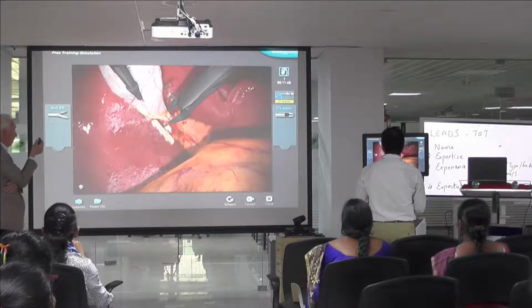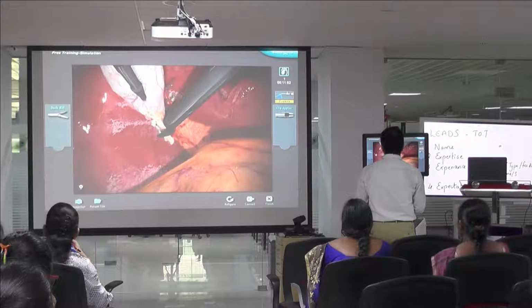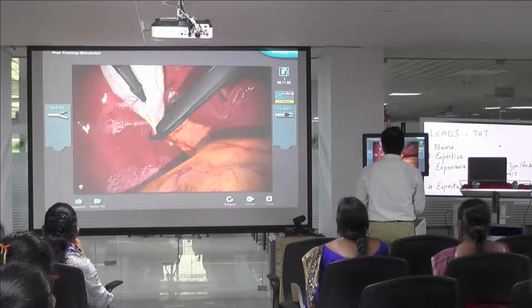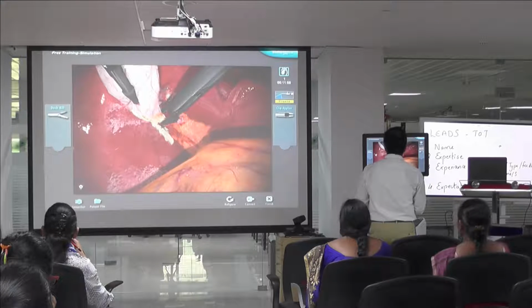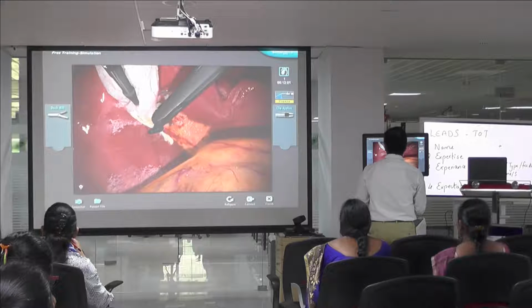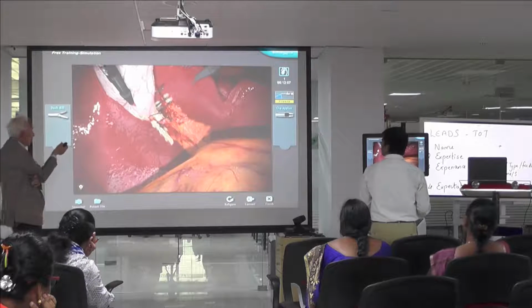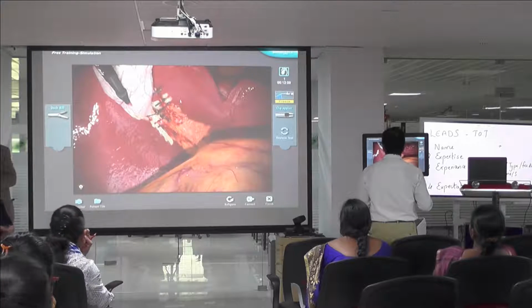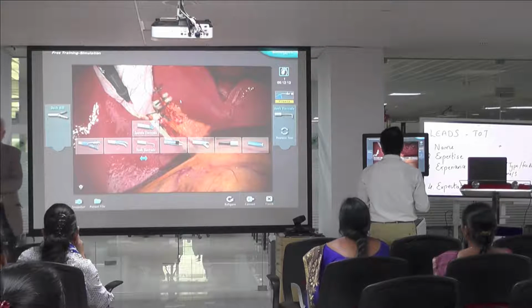And again, most important are the two central clips, and less important is the one on the side of the gallbladder, because this tissue will be anyway removed. So, okay? Good. So, the second task of this procedure, placing the clips, is done.